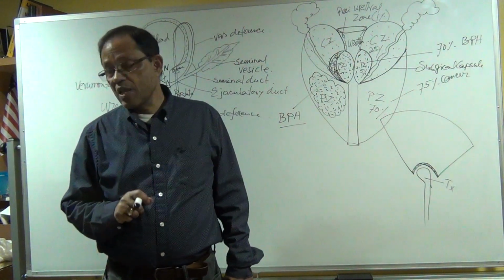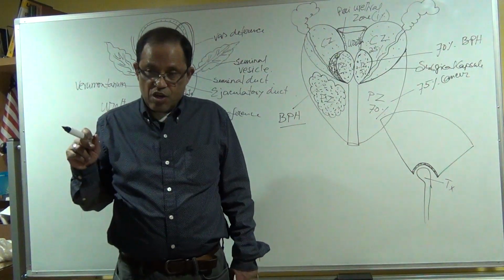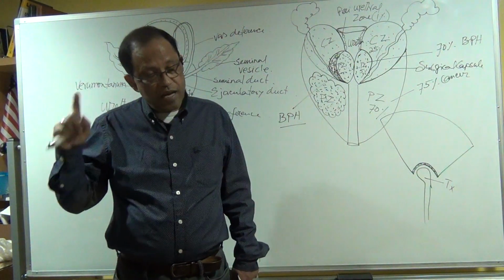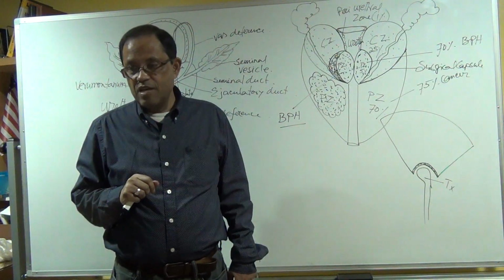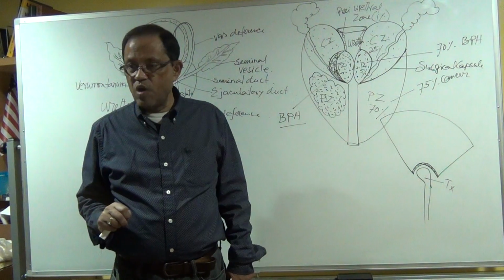Why? Because there might be a contraindication of rectal ultrasonography. Contraindication of digital rectal examination. Why? Take the history.